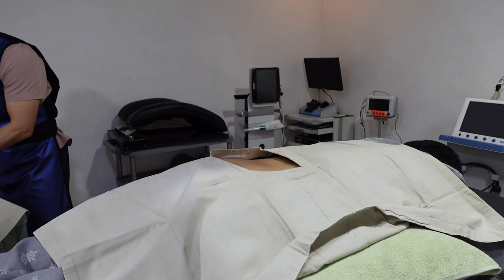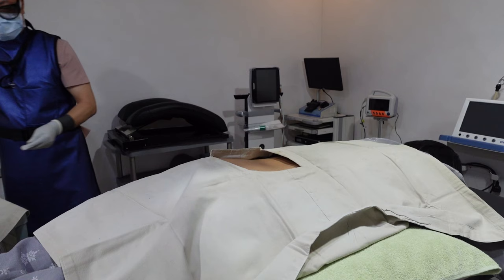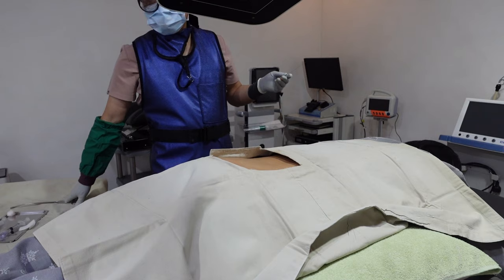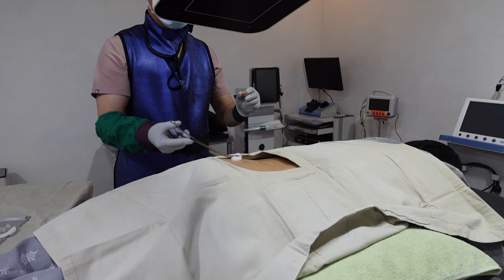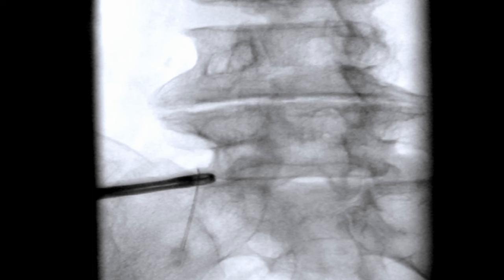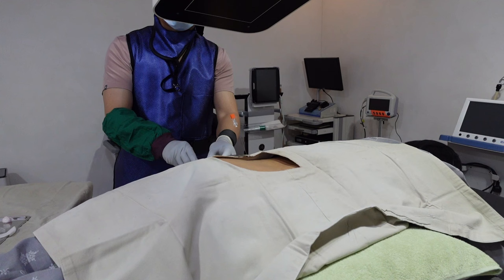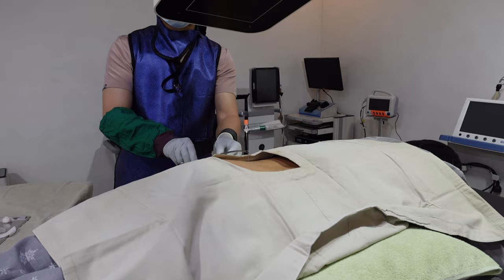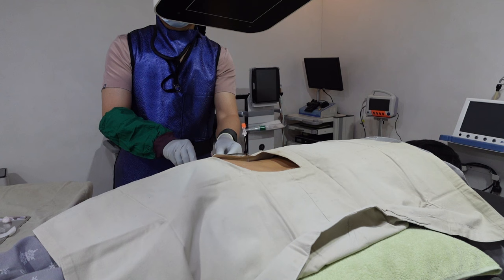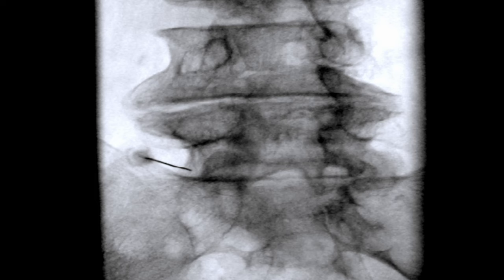Our next segment features a step-by-step video demonstration of the infranural approach for bilateral L5. A more steep cranial tilt of the C-arm is needed to approach the L5 transforaminal injection. After observing the transverse process of left L5, I rotate the C-arm to the left ipsilateral side. I initially approach with the needle held by long forceps, targeting the lateral corner between the superior articular process of S1 and the upper border of the sacral ala. Once the needle path stabilizes, I hold it with my bare hand for better tactile feedback.